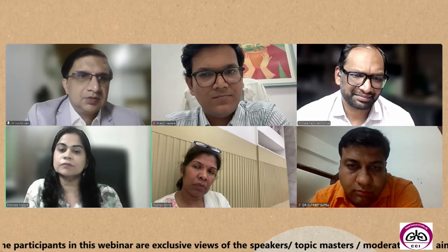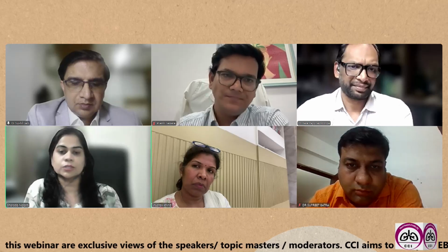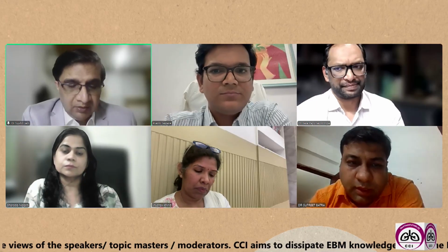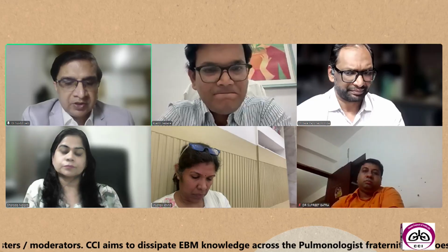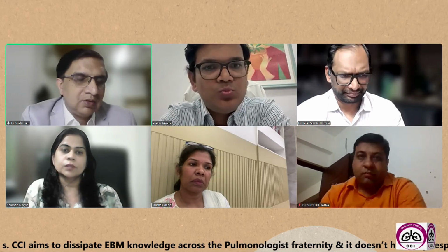Because sometimes even if the cells are very scant, we can use that cell block for immunohistochemistry. Thank you, Dr. Sharada. Continuing the same question, do you recommend preparing a cell block in all cases, and what practical steps can a bronchoscopist take to improve the cell block quality? So we need to know from you.